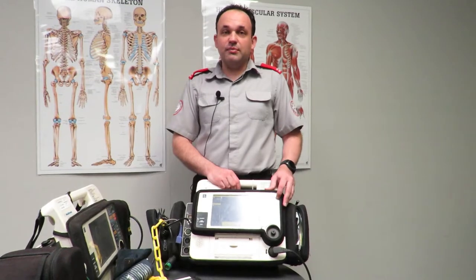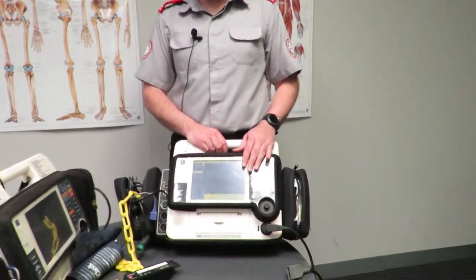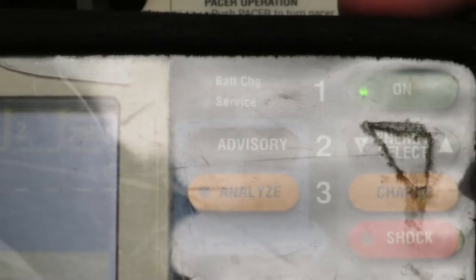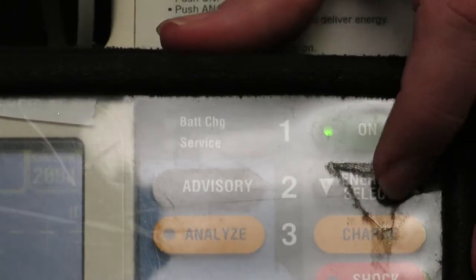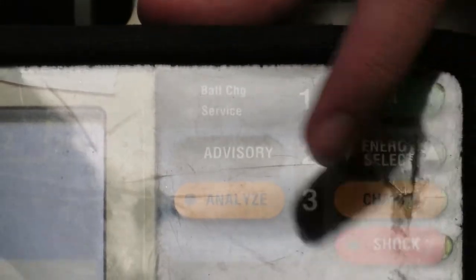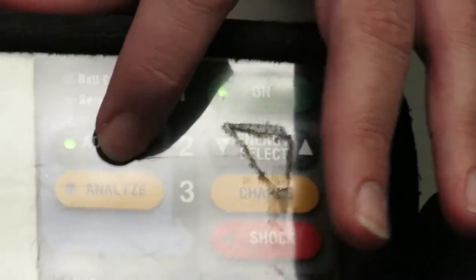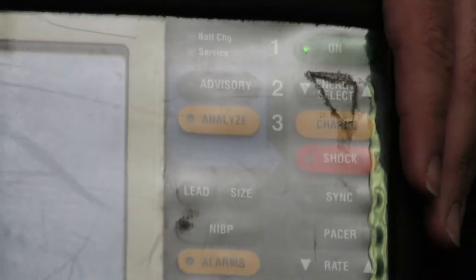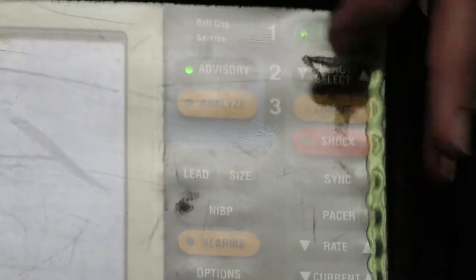Note that the unit needs to be in manual mode to do a test dump. If you press the energy select button, that light turns off. So if the machine is not working in semi-automatic mode, just press advisory again. Pressing advisory repeatedly just turns it on and off, alternating between the two modes. Make sure that light is on before proceeding.